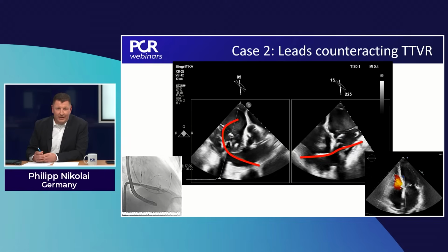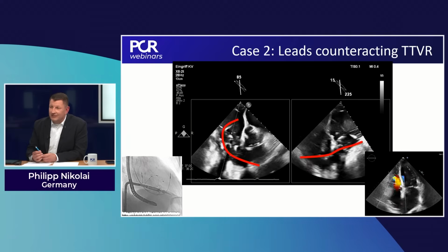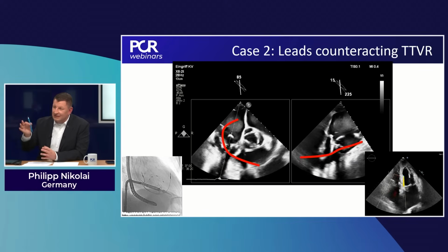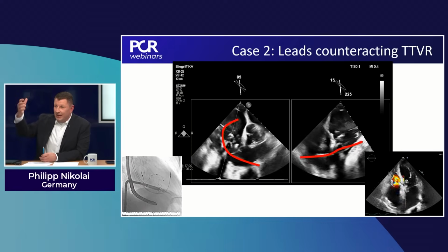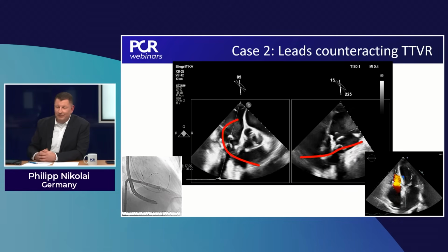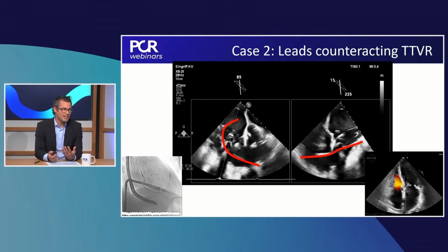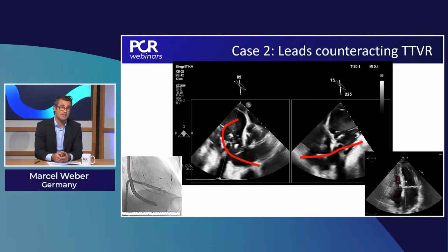implant the valve. What do you think about TricValve in these cases for the future? So the bicaval valve system that doesn't affect directly the tricuspid valve, so that's a bicaval approach. Yeah, so the heterotopic valve. What do you think about these cases? Yeah, when we know this result, of course, then bicaval implantation like TricValve would be the best option.